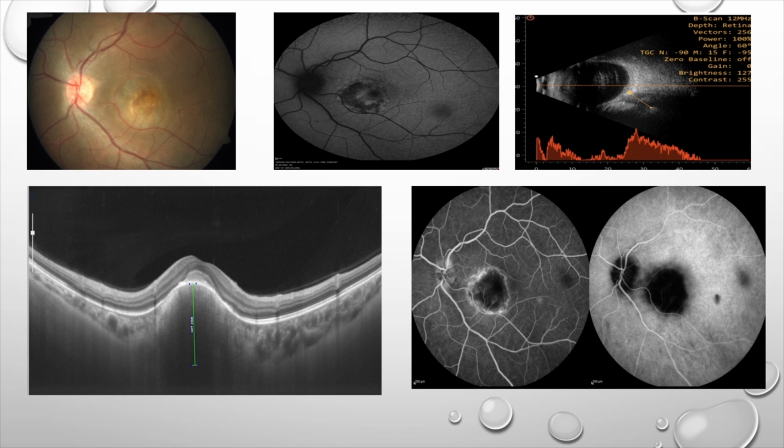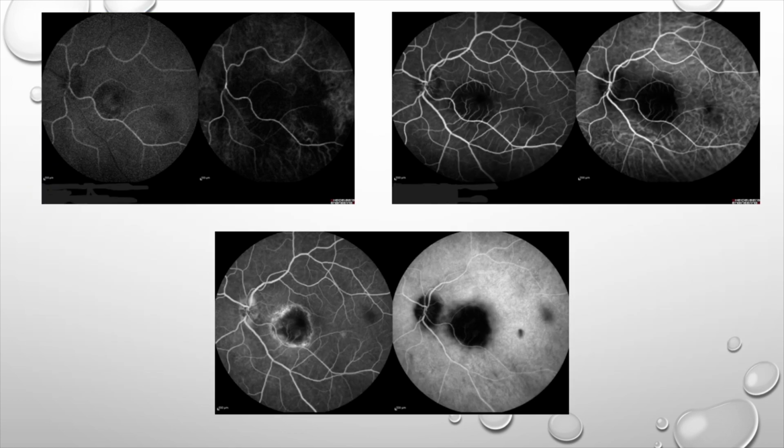So this point is very well taken, because in a pigmented tumor, like what ma'am said, the posterior margin is one thing which we cannot appreciate, and that too in a pigmented race like ours, it becomes very, very difficult. If you are having a melanotic lesion wherein the pigmentation is not too much, we can still use it. But the most important thing is we not only need the height, we also need the diameter. That is also quite an important criterion.